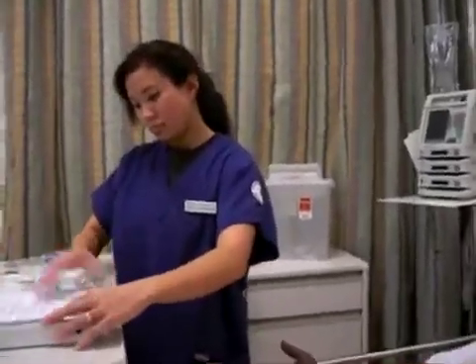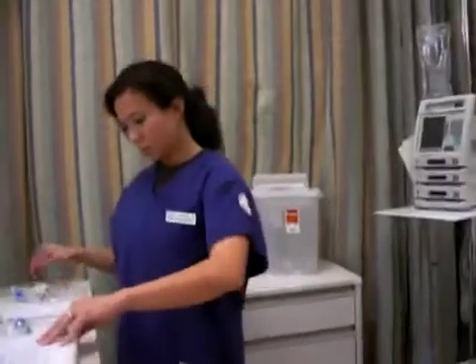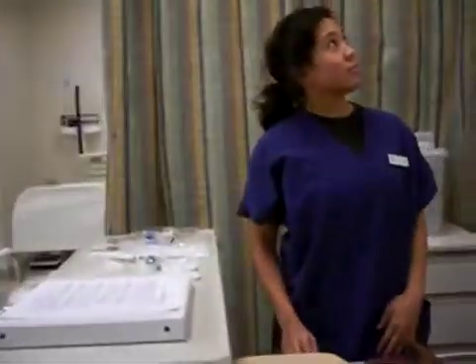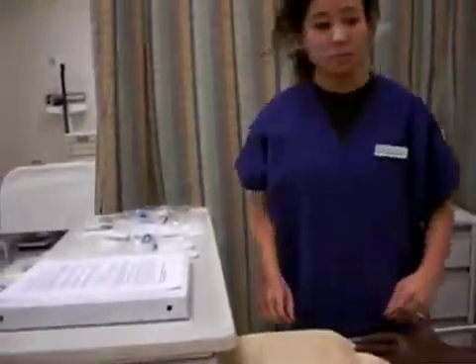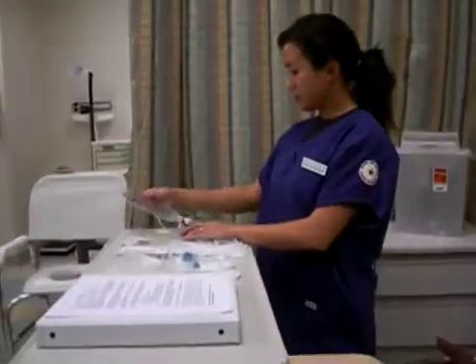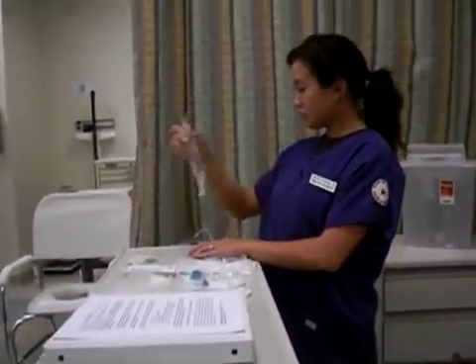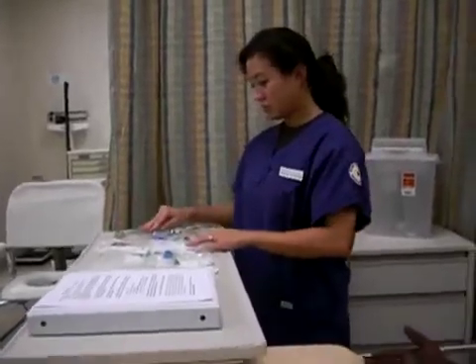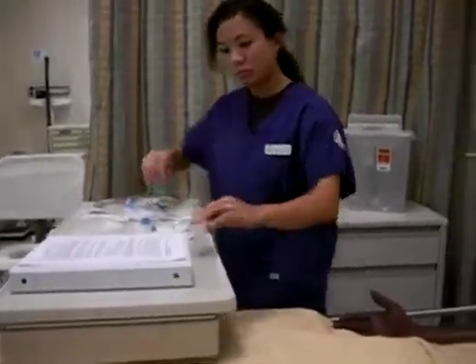The nurse follows 6 rights of medication administration. The 6 rights are the right patient, medication, route, time, and dose. The ID band is checked to identify right patient. The nurse checks the IV solution for color, clarity, and expiration date, and for any further leaks. The nurse assesses the patient's history of any drug allergies.